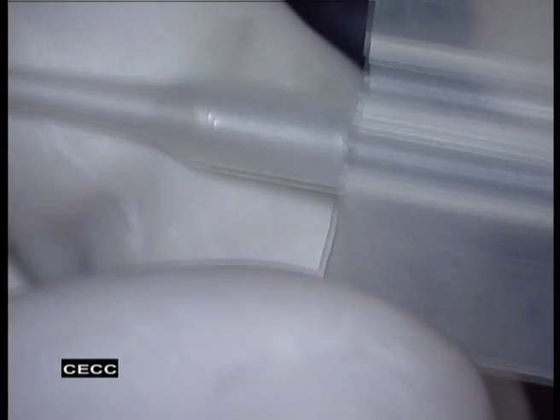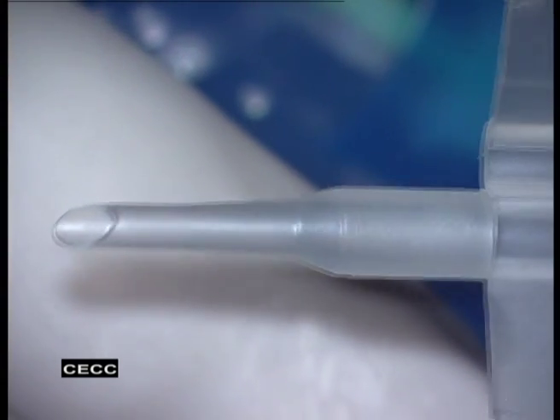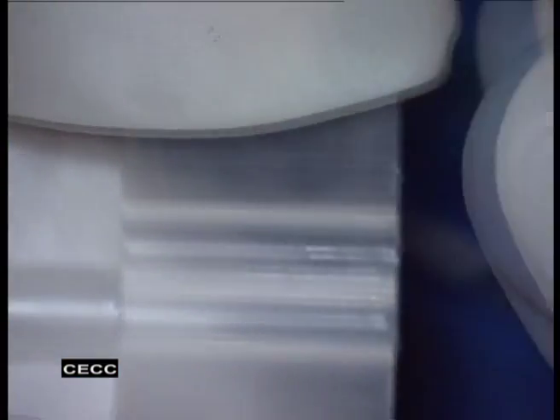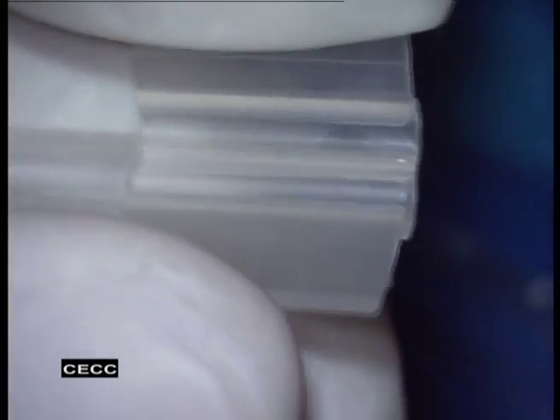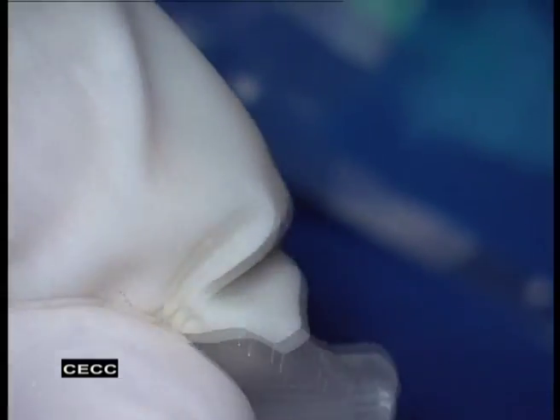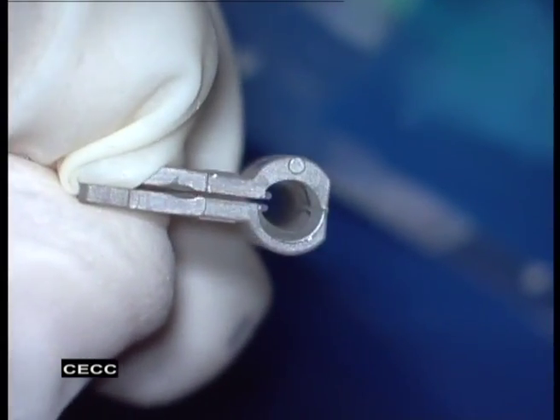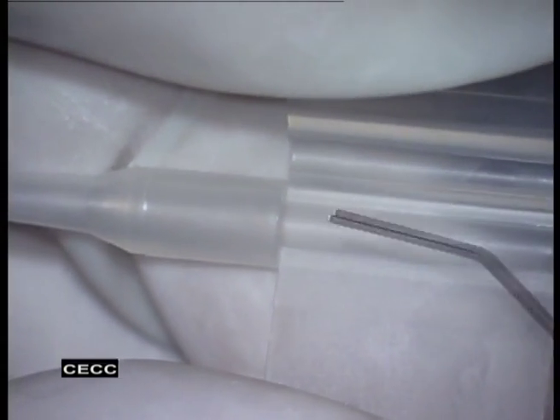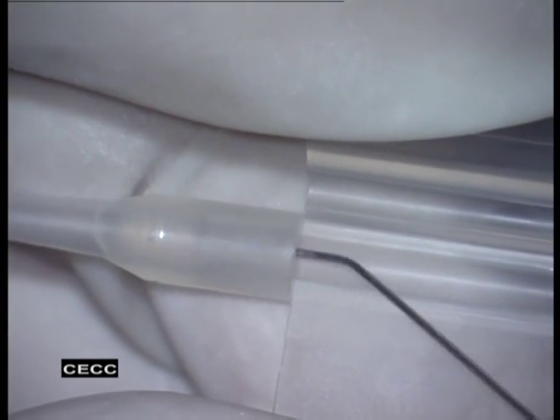The Sensor Emerald cartridge looks quite similar to a hydrophilic acrylic IOL cartridge. Inspect it thoroughly under the microscope before loading the IOL. The tube, wings, and trough should look okay. The closed wings should form a continuous tube. Inject OVD into the tube of the cartridge and along the bottom of both troughs.